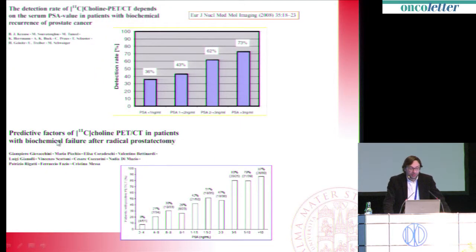It's been originally reported by German groups. So as you can see, the higher the PSA value, the higher the sensitivity of PET with choline. Well, unfortunately, in the clinical setting, we would like to be here.